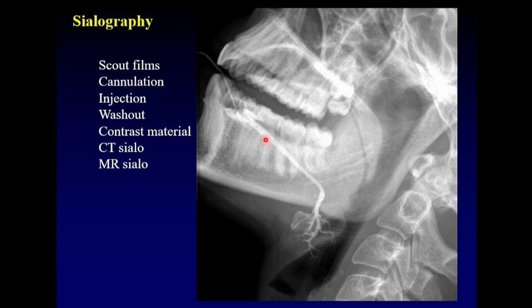This is an example of a normal sialogram. Notice that we have a uniformly tapering duct with very smooth walls. There is a regular branching pattern within the gland where each of the daughter ducts is smaller than its parent duct, and there is no displacement of the ducts within the gland itself.